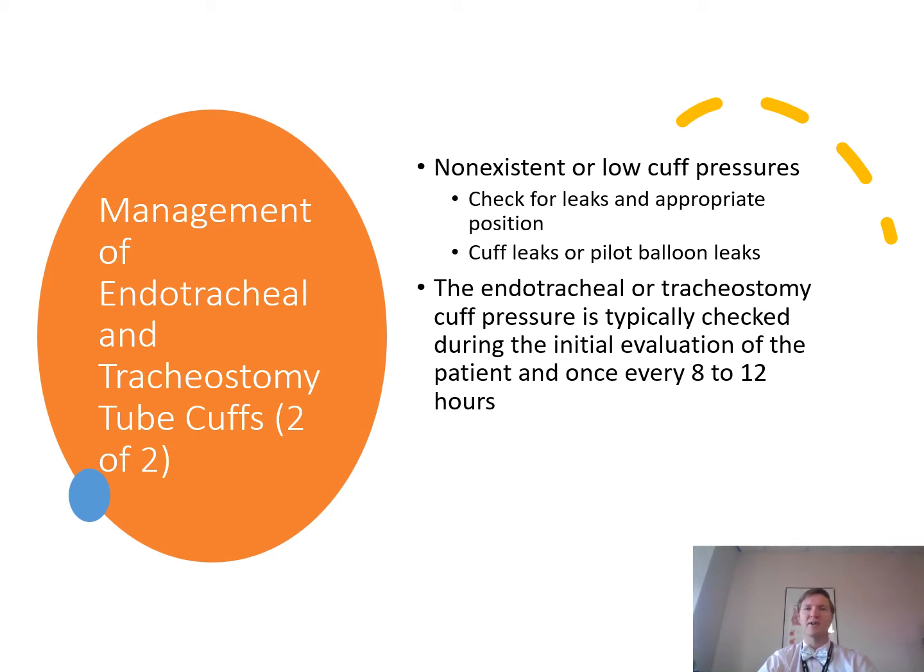If the leak is still present, it's located in the pilot balloon, so you've ruled that out. So the problem can be solved by clamping the pilot balloon. If the stopcock and the pilot balloon resolves the leak, then the valve is not working, right? So then you know it's the valve versus the pilot balloon.